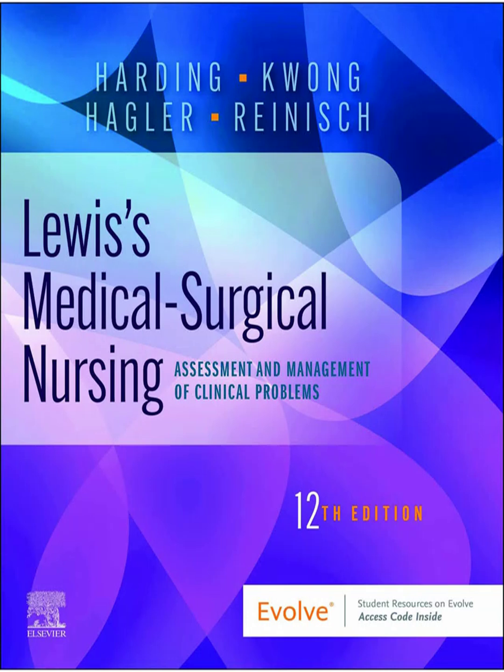We use defibrillator pads, and the energy level depends on the machine. Biphasic defibrillators are more common now, usually starting around 120-200 joules. The absolute critical safety point: the synchronizer switch must be OFF. You want that shock delivered immediately, regardless of the heart's chaotic rhythm, and right after the shock, resume CPR immediately. Don't pause to check rhythm right away.